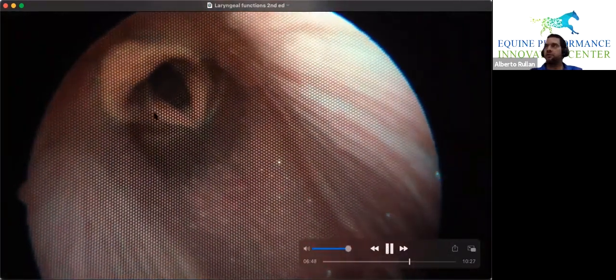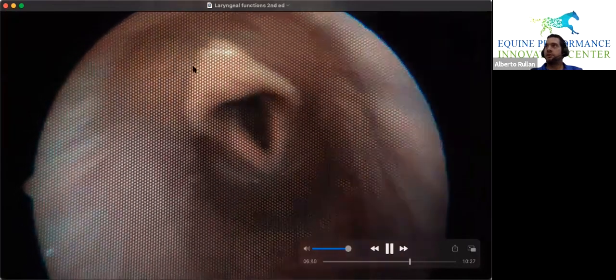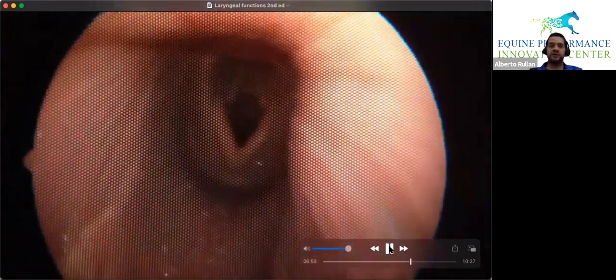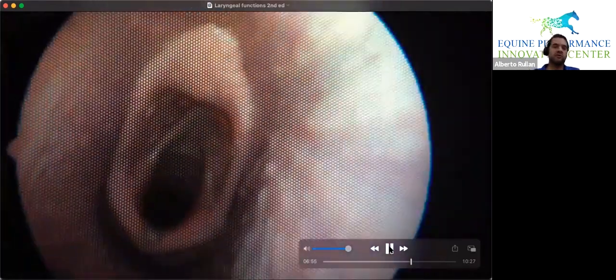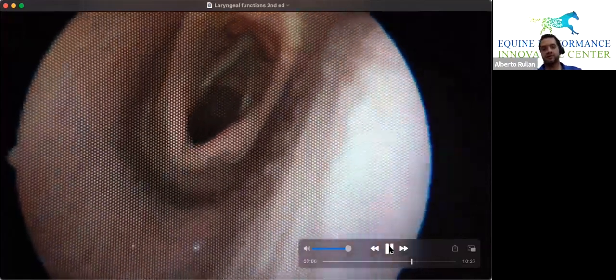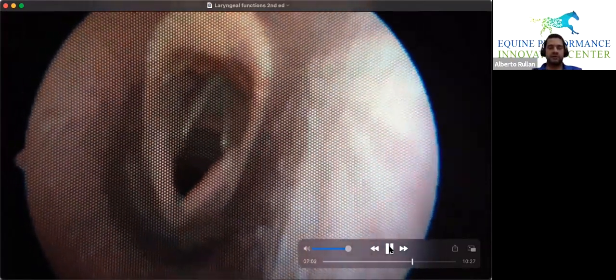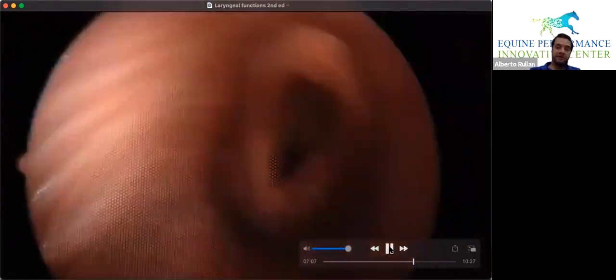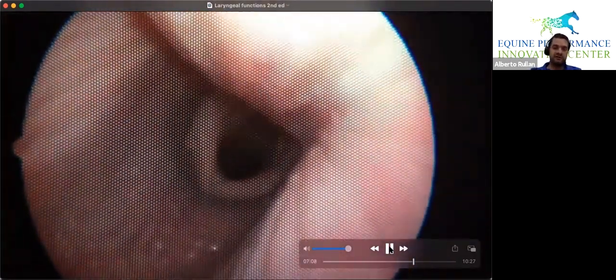So here's another example. Good size, good function, real time. This is what you're going to see when you're in the scope. It's going to be moving a lot, and you can get a good view, you can get a bad view. It just goes. Sometimes they're not as easy. And that's why I put these in these videos, because I don't want to just give you easy videos.